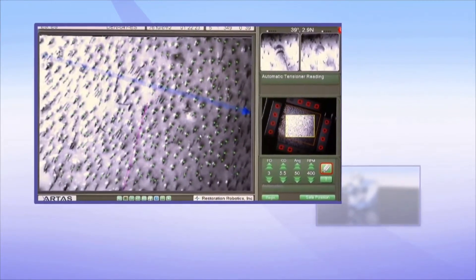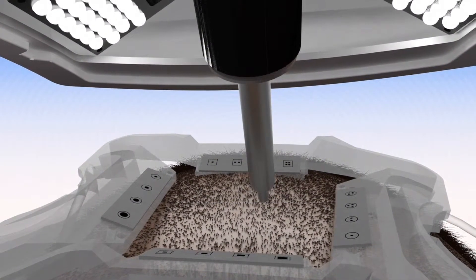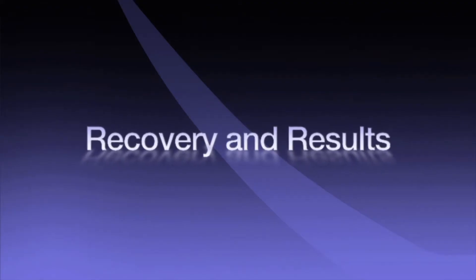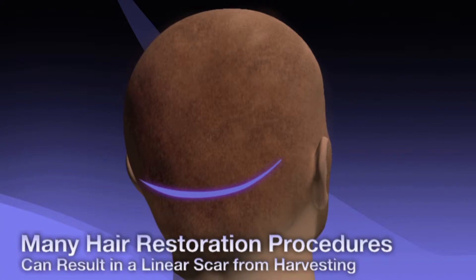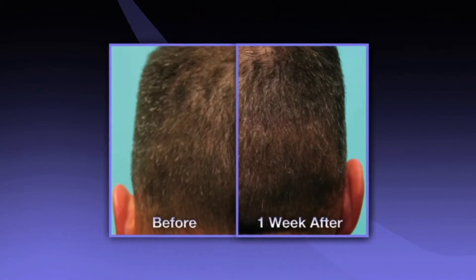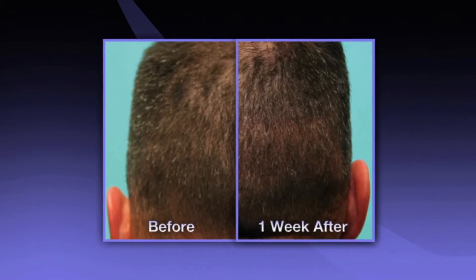The ARTAS system will methodically identify each follicular unit at its optimal approach to harvest healthy grafts for better regrowth after transplantation. Your doctor will use their artistic ability to design the best hairline for natural and permanent results. Unlike strip harvest surgery, the ARTAS procedure requires no linear incisions or stitches.